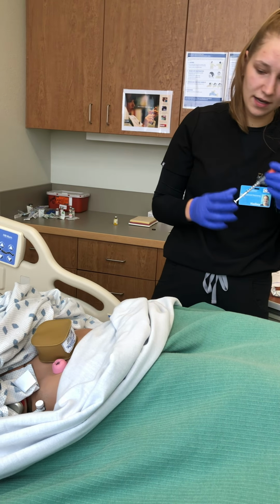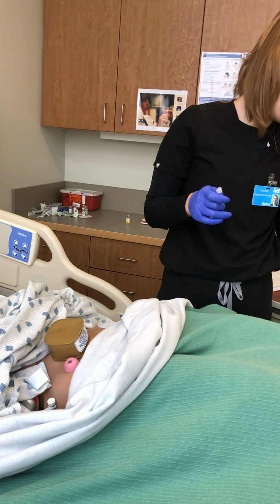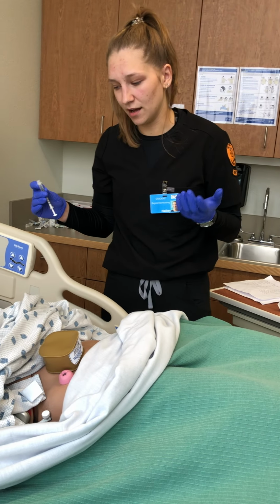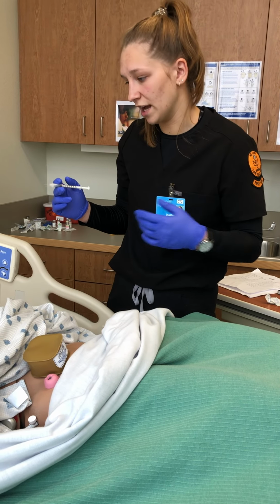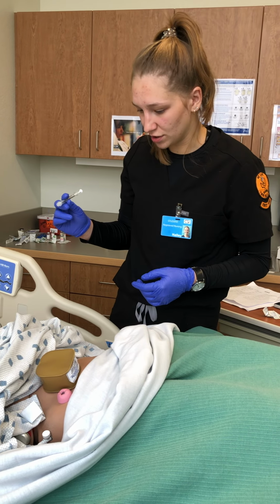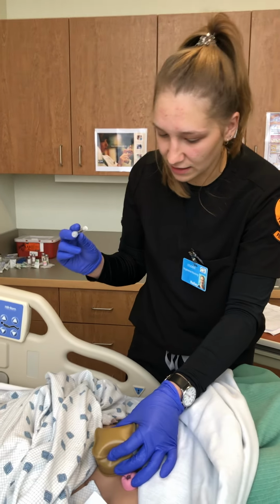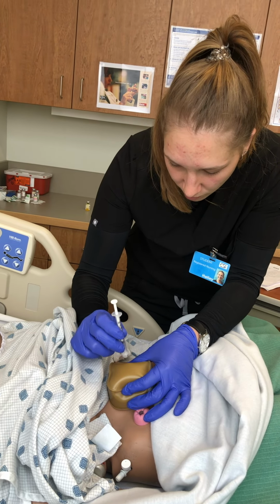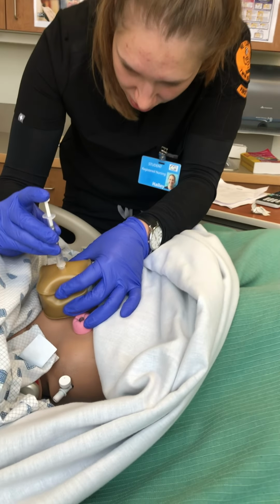So I'm going to go ahead and uncap this and make sure I'm giving it to the right client, which I have, the right route, which is subcutaneous. It's the right time, it's the correct dosage. I've educated you, I've explained the reason as to why. I'll document it once I've done all of the administrations of all the medications. So I'm going to go ahead and pinch the skin so I can get it into the fatty layer of the subcutaneous. And on the count of 3, I'm going to go ahead and poke you. 1, 2, 3. And I'm going to administer the medication.